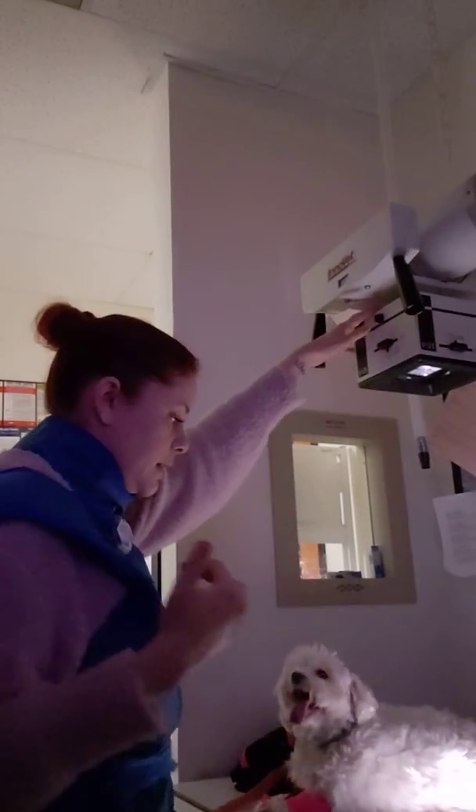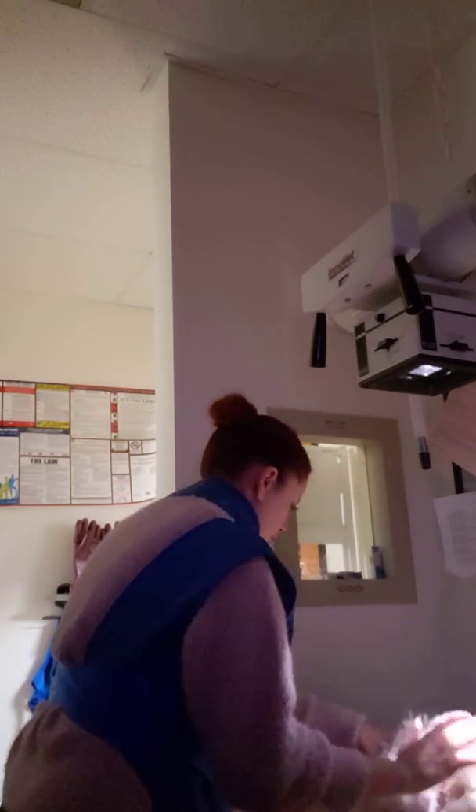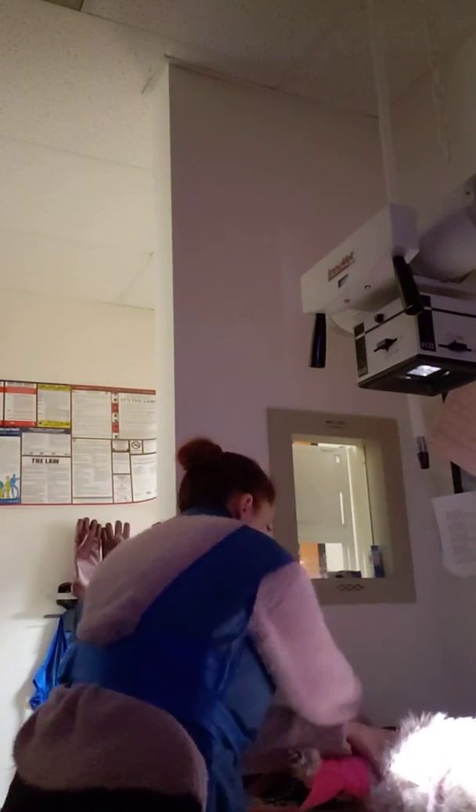I'm going to turn on my collimator and put her in lateral position. I'm going to put my little marker there and just take a picture of her abdomen. I have previously made these socks with rice in them to hold her down. In our trial run she kept getting up, so I used a little piece of vet wrap to wrap her front legs so that she didn't try to get up.